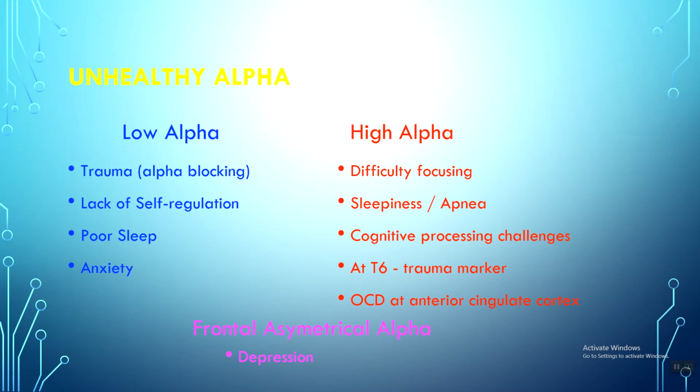I think you have more right side. Generally, people with depression have a lot more on the right side, a lot higher amplitude alpha on the right side. This is such a good question, and I just wrote about it. I think it's a factor of double, where it becomes really significant when alpha on one side is double the size of alpha on the other.